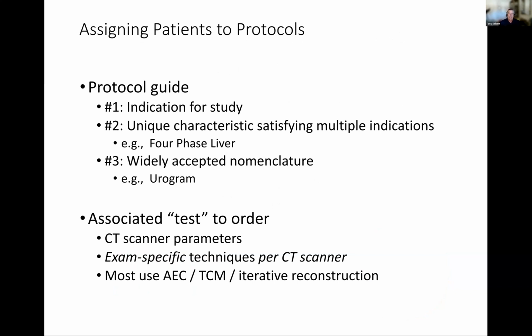The protocol guide that we've developed at UC Davis is a compendium of Excel documents for specific radiology divisions, for instance, abdominal, neuro, pediatric, cardiothoracic divisions within radiology. And each division has its own number of protocols.